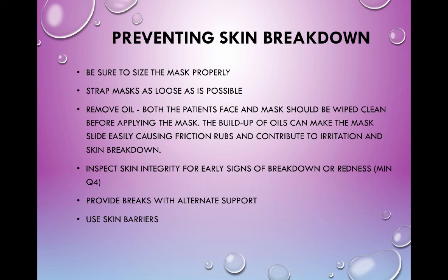So another way to prevent skin breakdown is lots of breaks. There's a misconception that it's like an ARDS patient you have on a ventilator. You take them off the ventilator, you're watching the second hand as they desaturate and try to die on you. A patient on BiPAP isn't going to be like that. We can take a patient off of BiPAP, give them a little break, maybe wet their mouth a little bit. Hopefully they can stay off for even longer.